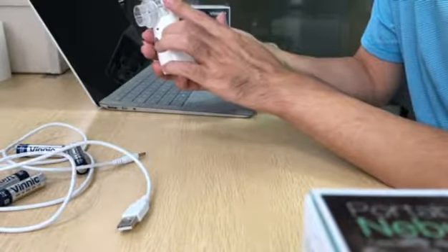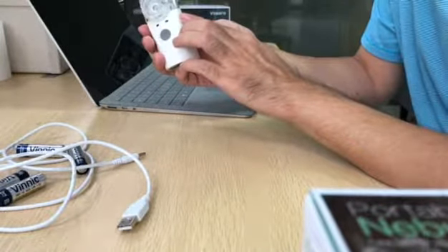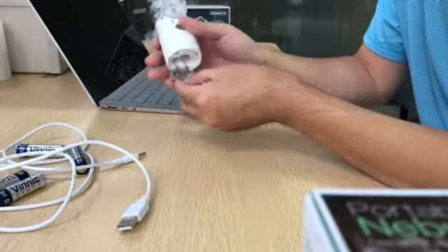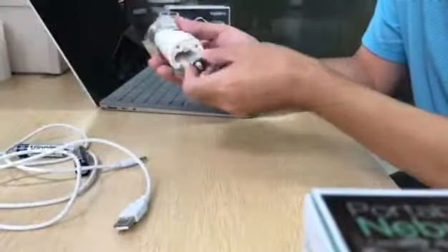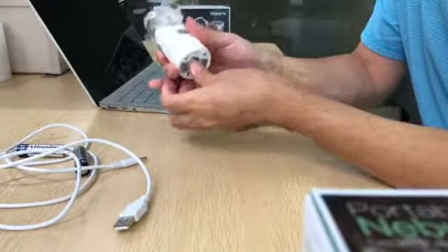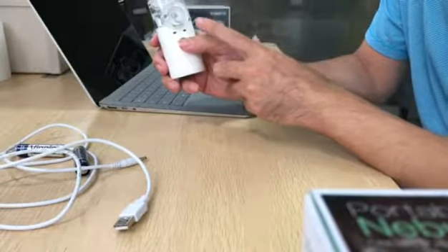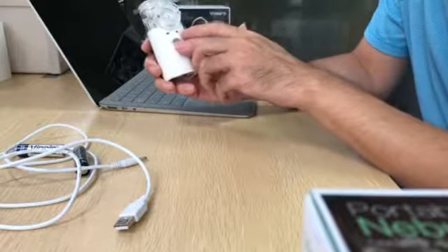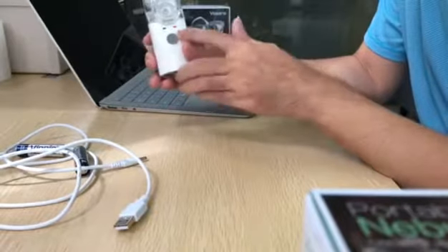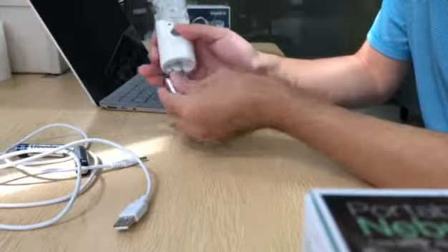If the cap cannot connect with the nebulizer, that means it cannot work for you. So put the battery into the nebulizer. You can see a very vague mist, and you can see the red light. That means the battery has low power. Now you can change the batteries.